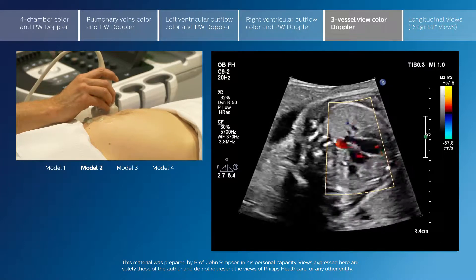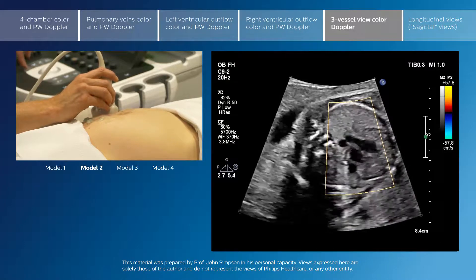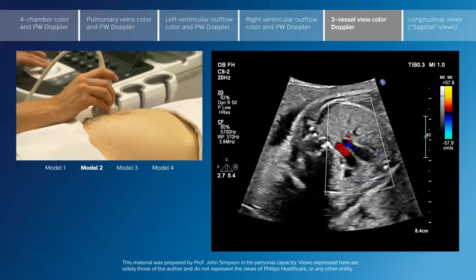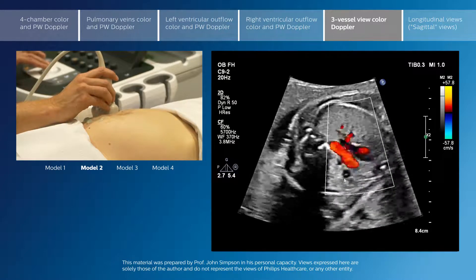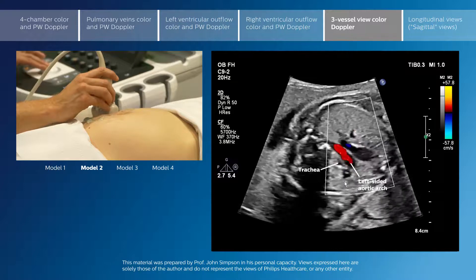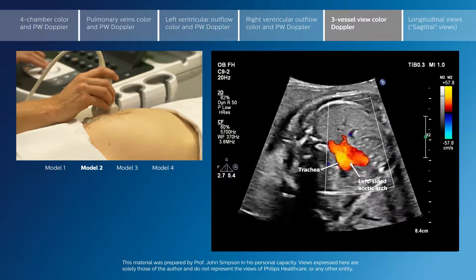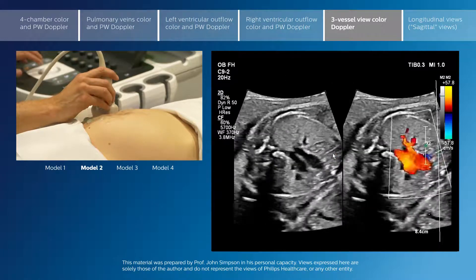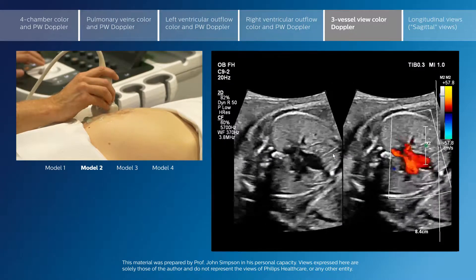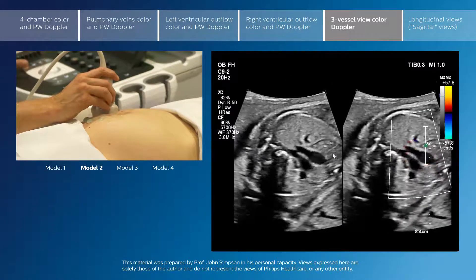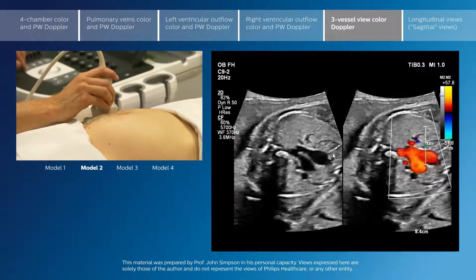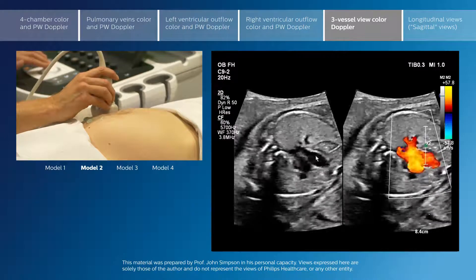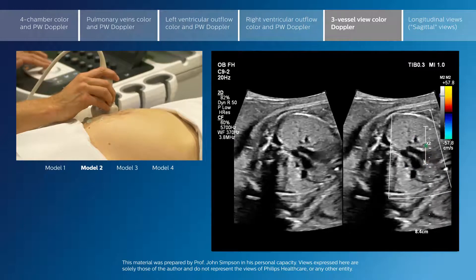We do not see flow so well in the SVC because it is seen in transverse section and is therefore coming through the ultrasound plane. If I show you this with the colour compare modality, we can see both the cross-sectional view and the colour view of the same vessels.